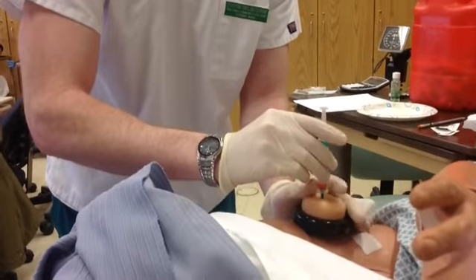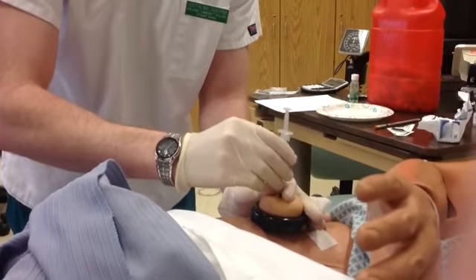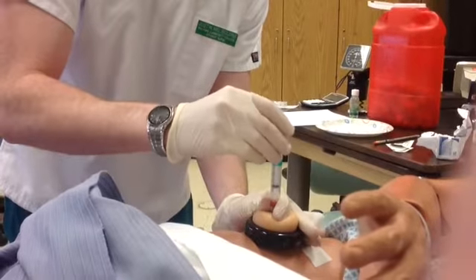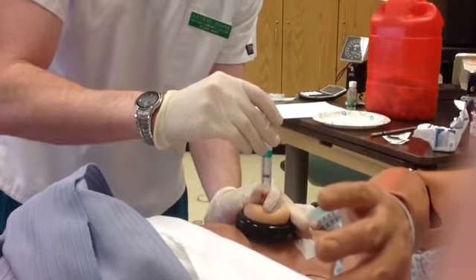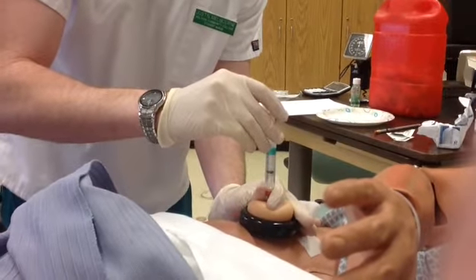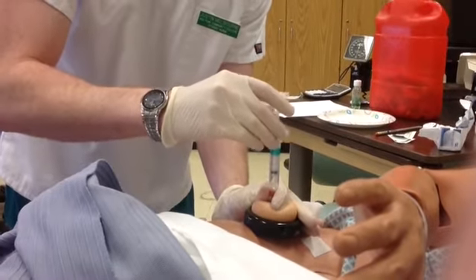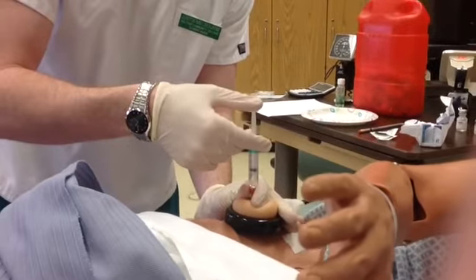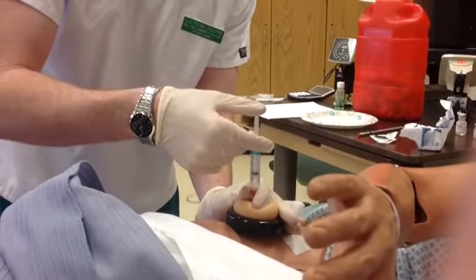I'm going to hold the syringe with my non-dominant hand, going to aspirate because this is a medication and not a vaccine, so there's no blood, and I'm going to inject the site slowly because this is a thicker medication.